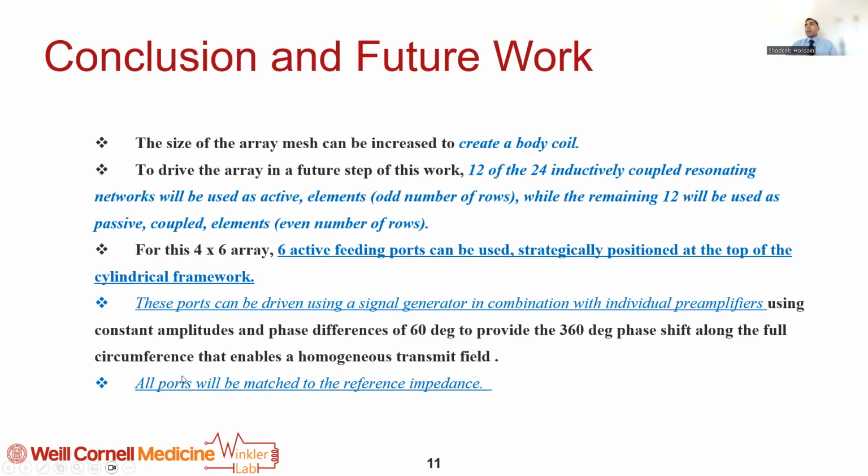And it's always best practice to avoid an impedance mismatch, so you have to make sure that's also taken care of. This is some of the future work.